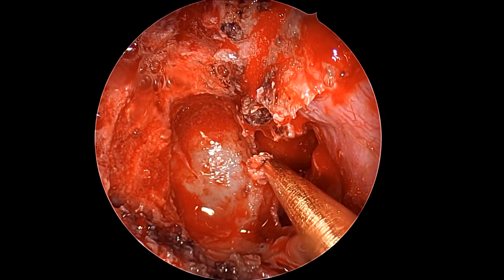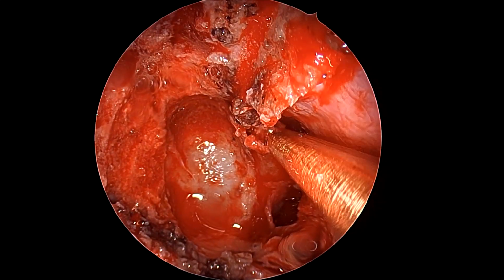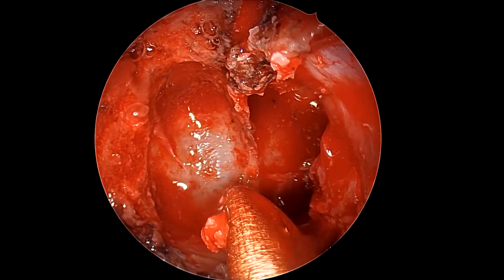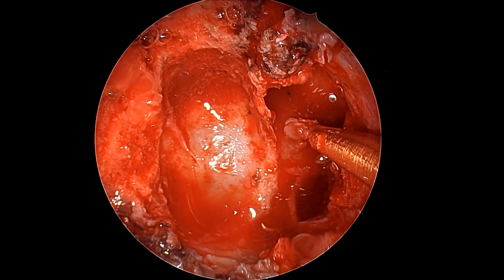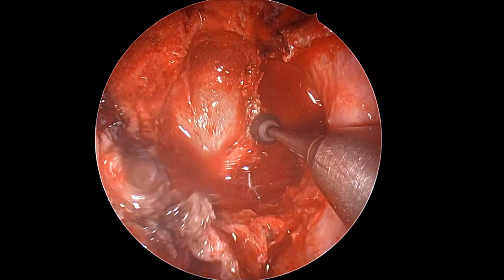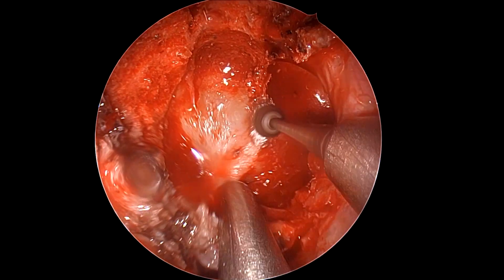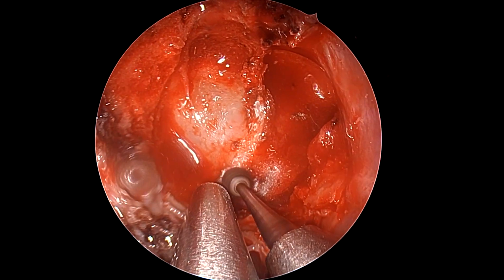In between, one can obviously use the bone punch as well to remove any sharp places of bone. It's quick. It doesn't cause any bone dust or heat, and doesn't require many hands. As of now, we are just using 2 hands only within the bone punch to sharply cut through the intersphenoid septa in the bone and not avulse it. And post that, once we have some more space, we use the drill by drilling the entire base.